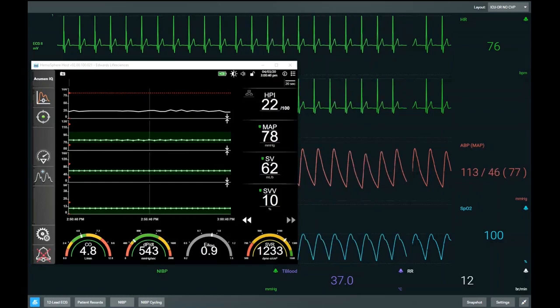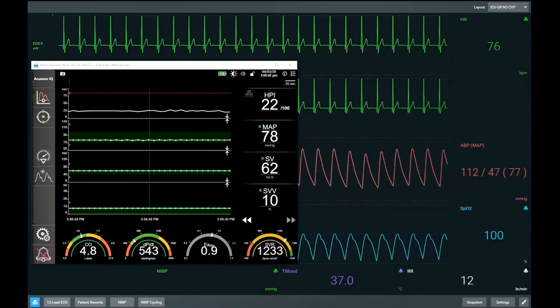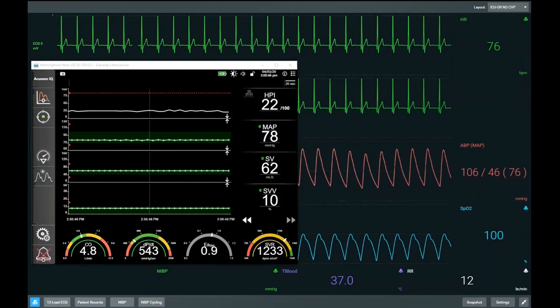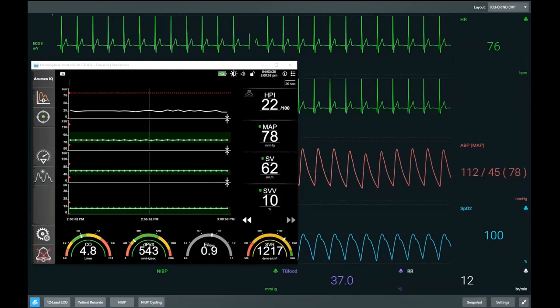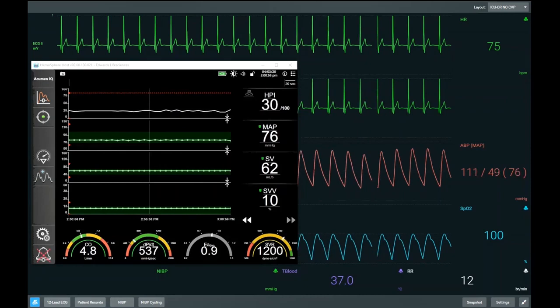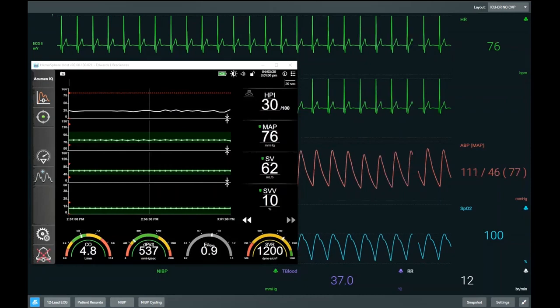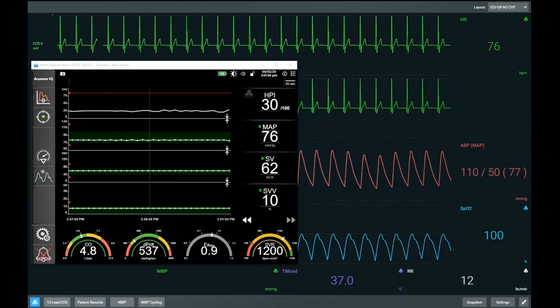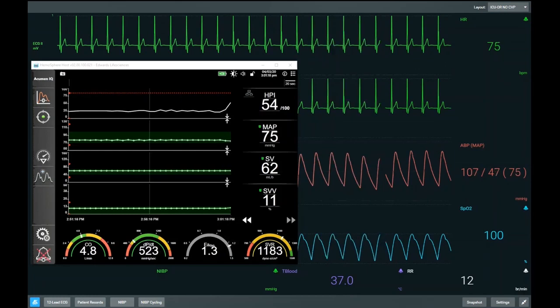As we start the simulation, our baseline parameters are looking in very fine shape. Our heart rate is 76. We have a normal blood pressure with a mean arterial pressure of 78, and the patient is well saturated. Our HPI is 22, and our mean arterial pressure, stroke volume, and SVV are all within normal ranges. So we have stability as we currently stand.